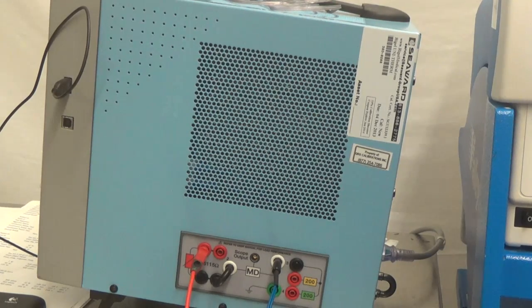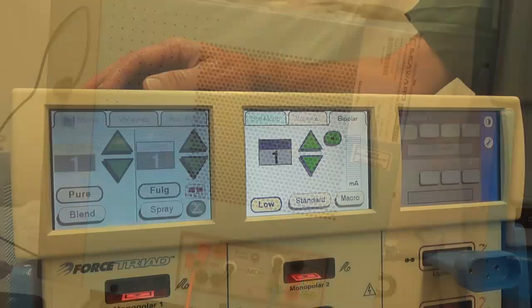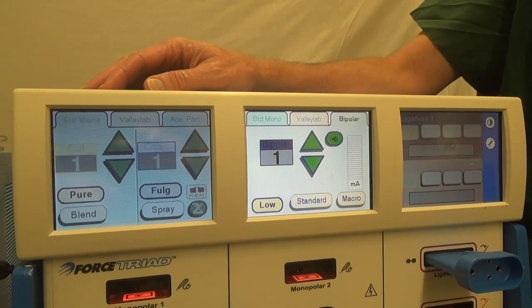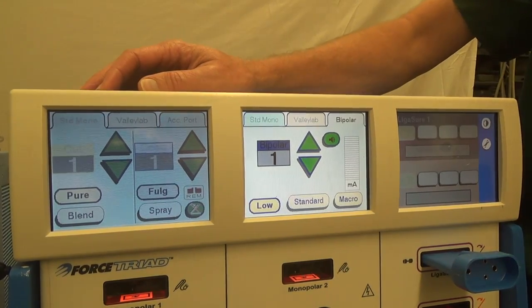Each measurement that you perform with the Rigel Uni-Therm actually has a diagram that comes up on the screen and shows you exactly what to do, whether you're doing an HF leakage or an HF power. So now we'll begin demonstrating how to perform the PM of the Covidien Triad ESU with the Rigel Uni-Therm ESU analyzer. Power both devices up, and this is how it comes up.